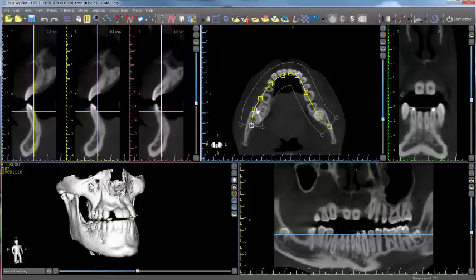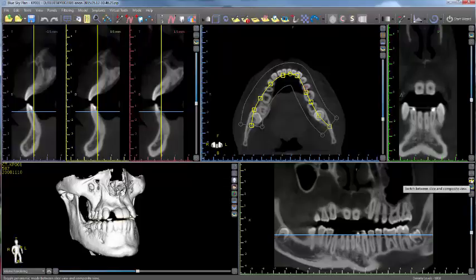Additional functionality includes the following. The center button to the right of the panoramic bottom right view allows the user to control if they are viewing a single slice in the panoramic view or a composite view of all the panoramic slices together.